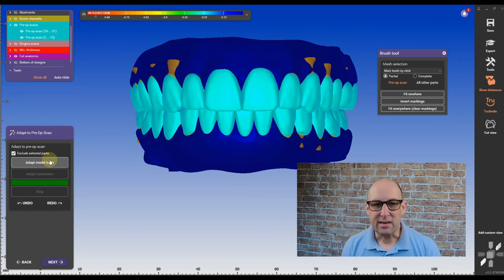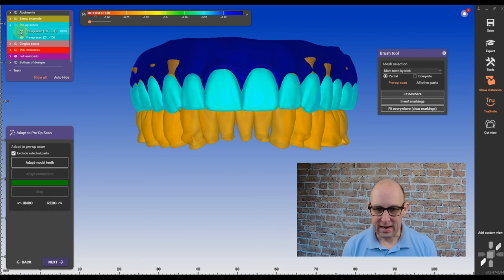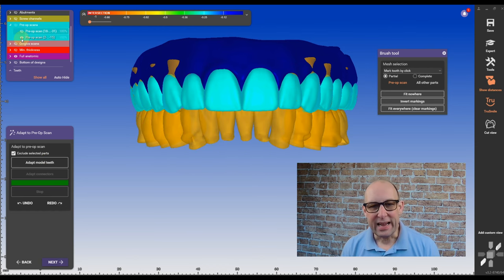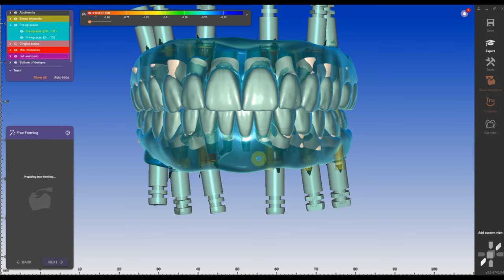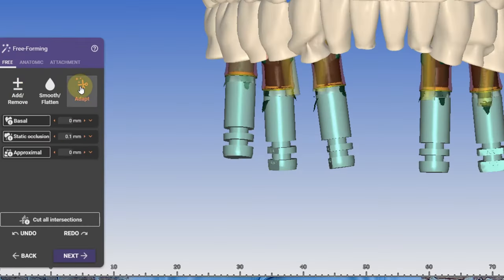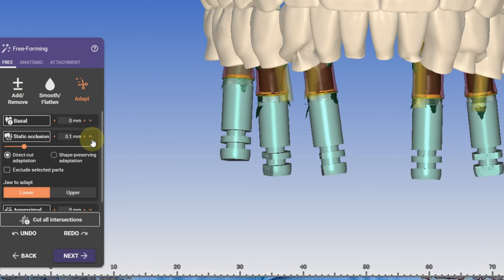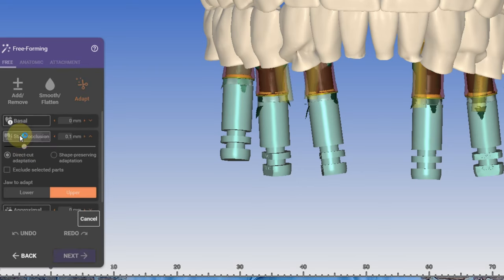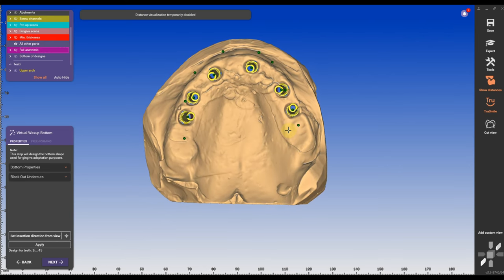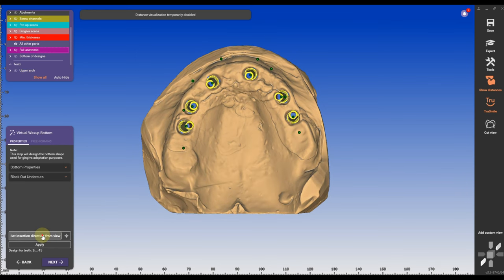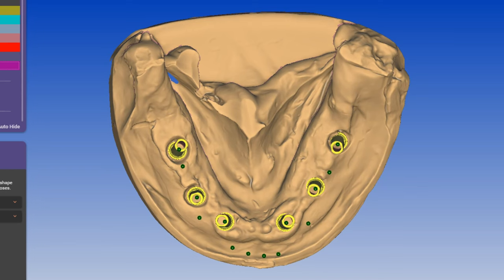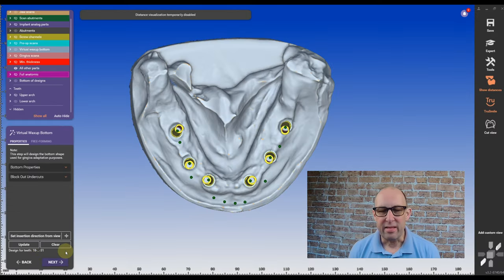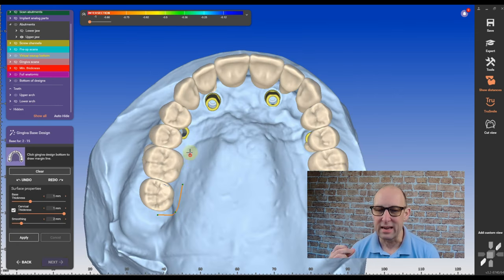After the adaption to the pre-op has been completed, I can now go into the free-form mode and adjust the design. I'm going to go into free and adapt and adjust the occlusion. I'm going to set the settings to 0.1 and I'm going to adapt it first on the lower and then 0.1 on the upper. So I have a total of 0.2 adjustments on all arches. Now I'm going to set the insertion directions for my virtual wax-up bottoms. I'm going to repeat it on the lower arch and when everything is completed, I can go and move forward with the gingival design.